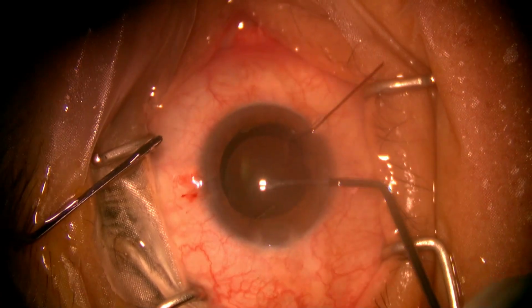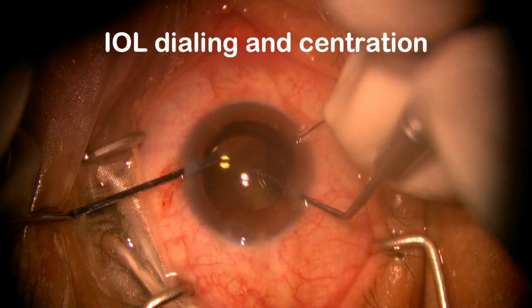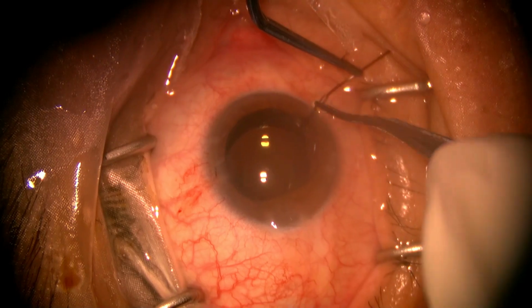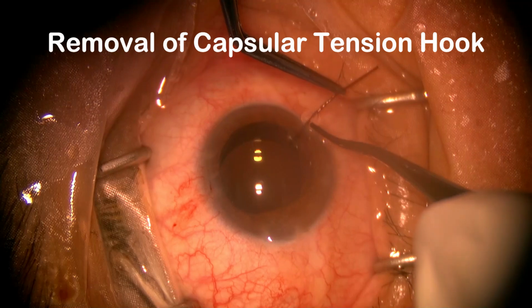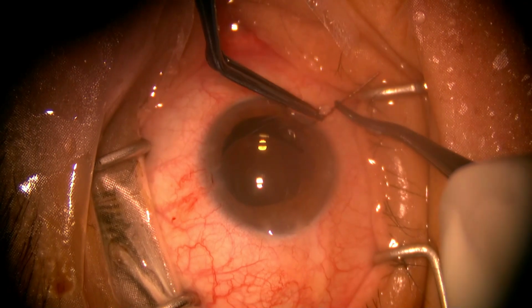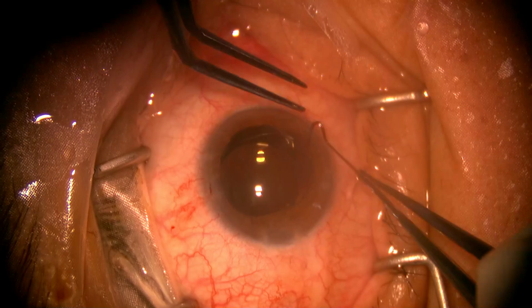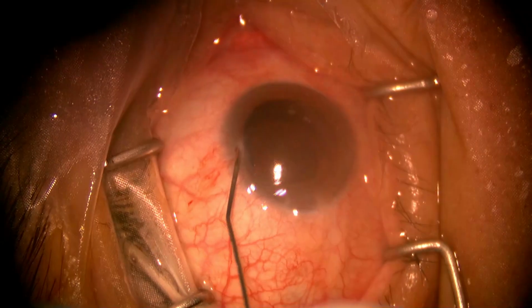strength to the bag, followed by IOL dialing and proper centration of the IOL. This picture depicts the posterior capsular intraocular lens in place and well centered. Now the capsular tension hook is being removed as depicted in the video. Now the side port and main port are being hydrated.